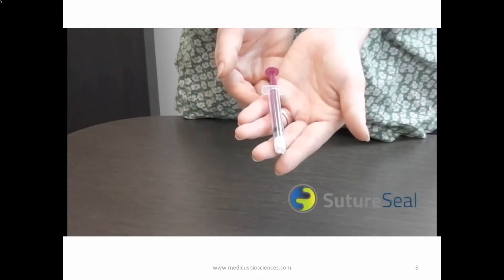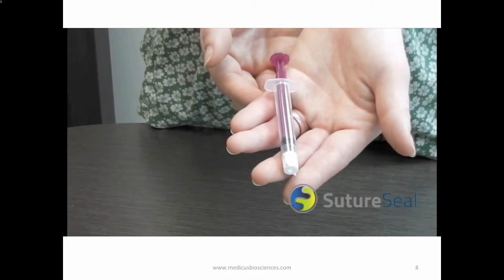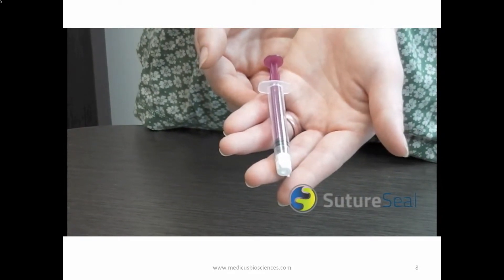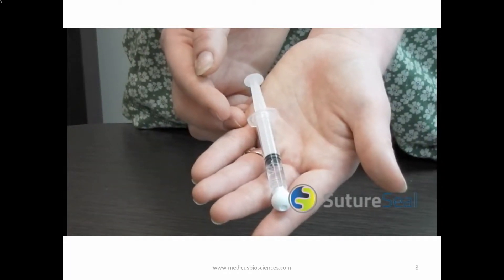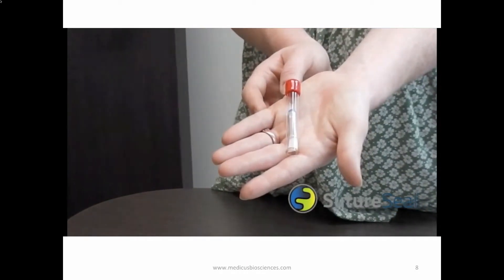Inside the foil pouch you will find two syringes: one 2.5 mL syringe containing solid white powder — the gelling agent — and one 3 mL syringe containing a liquid phosphate buffer solution. Also included is a sterile application brush.